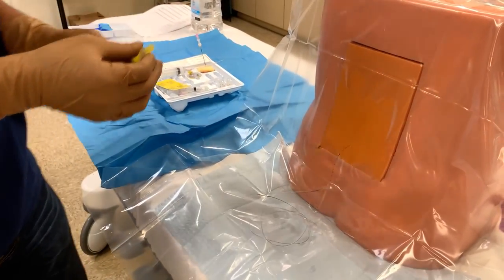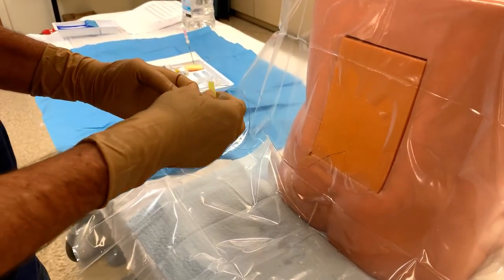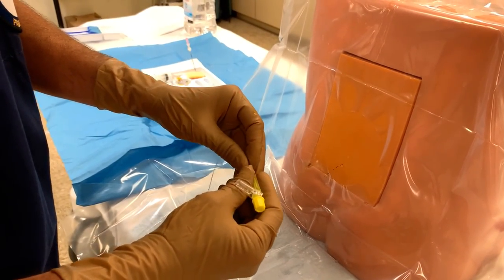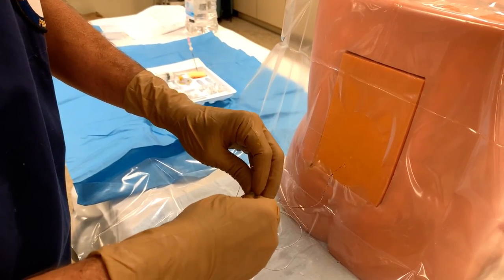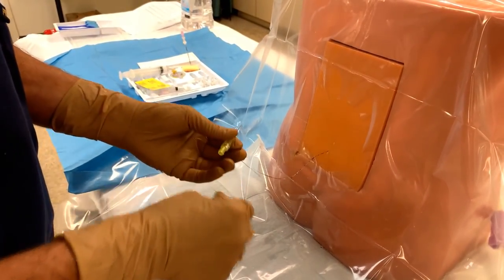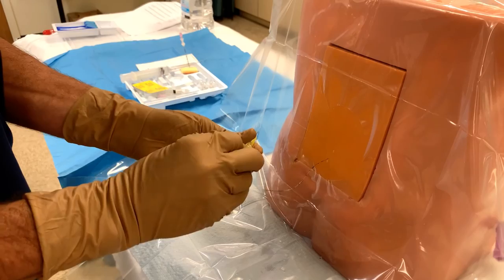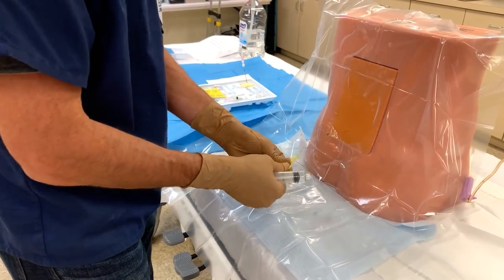With the catheter properly placed, we'll now attach our luer lock connector — push it all the way in and snap it down. That's on there. We'll go ahead and place our filter. Now we're ready to inject our test dose.